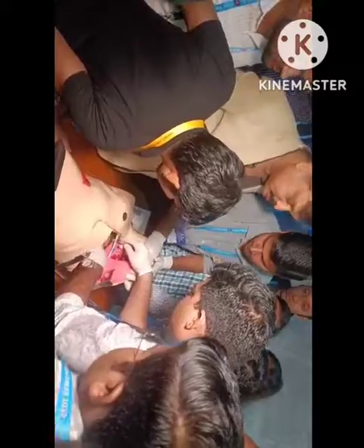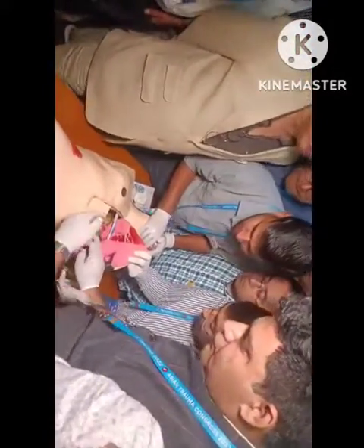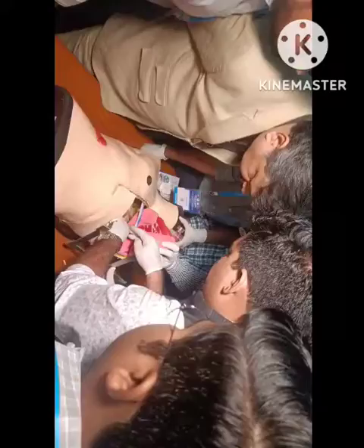Yeah. See. So that's what happens in a real scenario also. So where is the bleed? Expose the heart. Where was the wound? So this is the reason why he is having tamponade. Can you see the bleed?